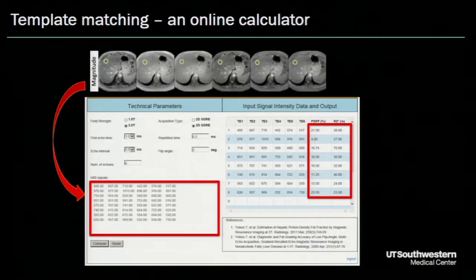A point of note is we have begun to use this online calculator in clinical practice now. Some of our scanners are not equipped with a quantification sequence, and also we use this as a backup just in case when you have acquisition or reconstruction failure.